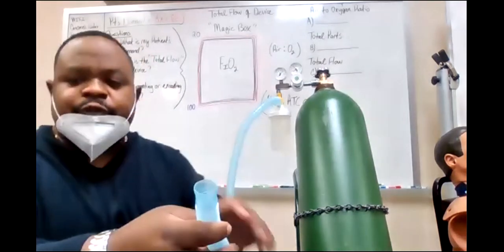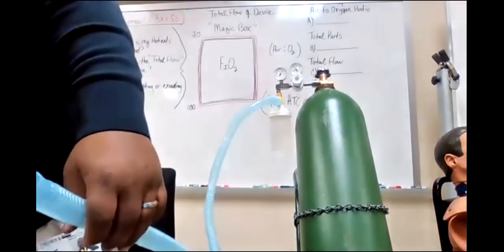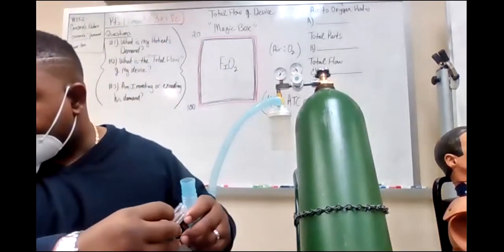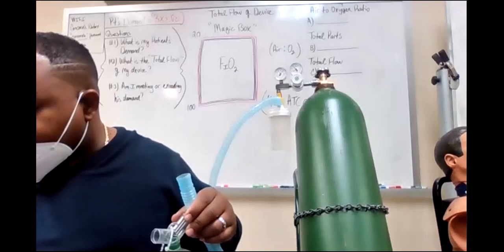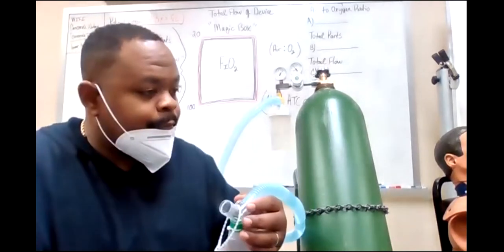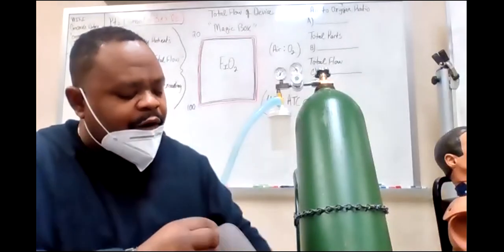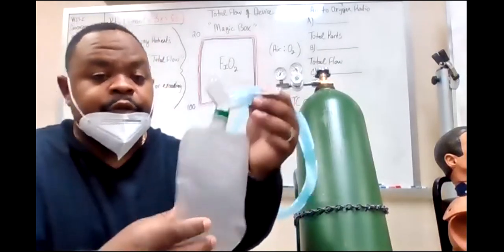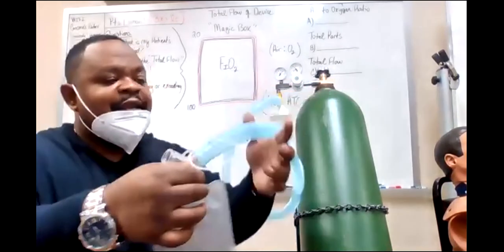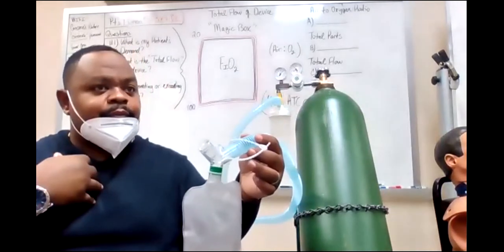Okay. So I got my large bore tubing, and then now I need something to trap that water. And that's called a water bag. I need my water trap. Lisa McCarthy: Do you use sterile water or just regular tap water? I use sterile water. Yeah, it's gonna come already sterile, distilled or whatever. So now I have my water bag.